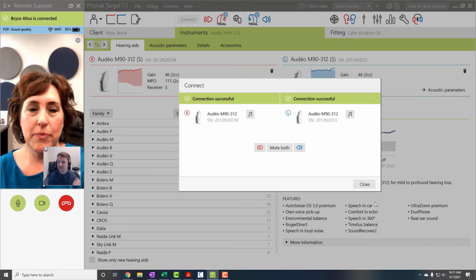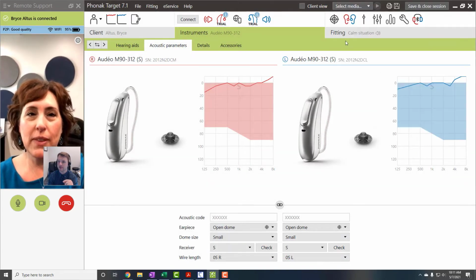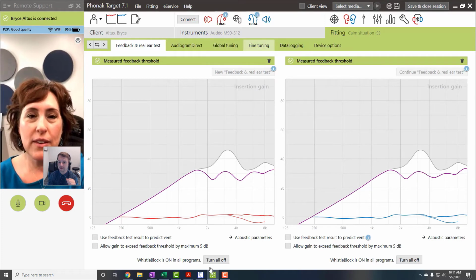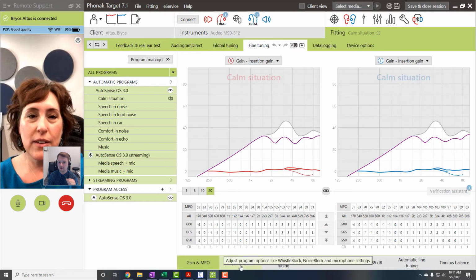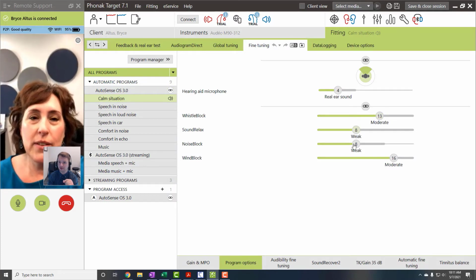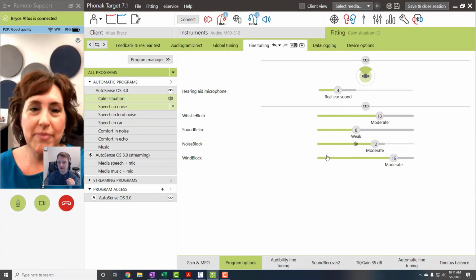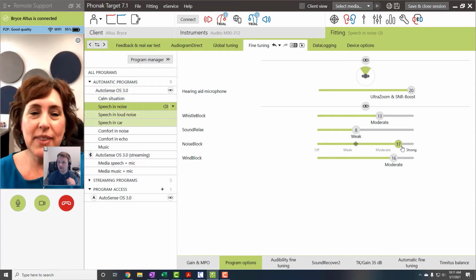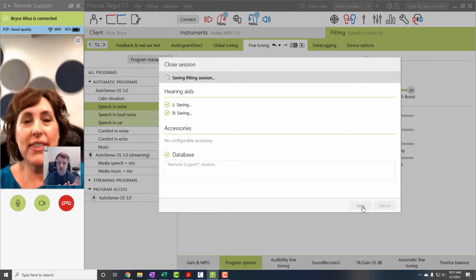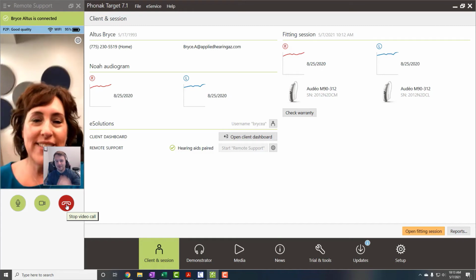Almost all programming capabilities that we would typically have in an in-person appointment are available to us when programming remotely, allowing us to address almost all issues or concerns that you may have. As long as you aren't experiencing any physical issues with your hearing aids or any of your hearing aids components, then odds are we can address your concerns or make the required adjustments remotely through a remote session. At the end of a remote session, we will then save your programming adjustments to our database and then disconnect from the remote programming session.